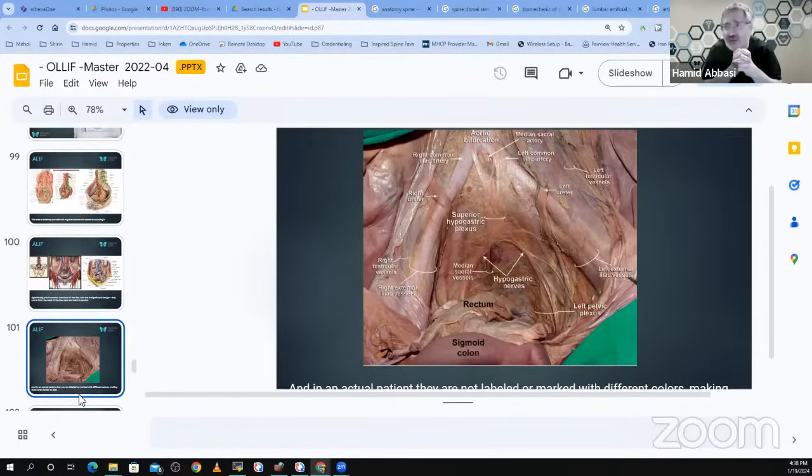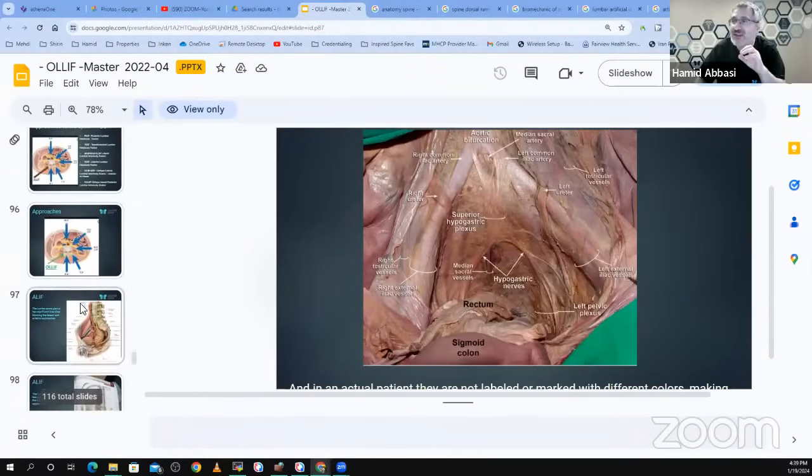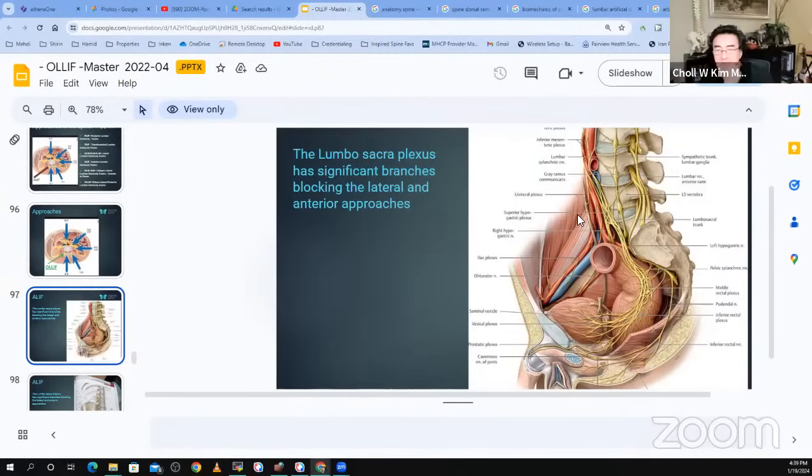You have to identify all those vital structures. You have to preserve them. What if I told you in this town, once a year, somebody dies of that surgery from the front, at least, that we injure certain structures that are very vital. And you have to do all of that before you get where you need to be, which is the disc itself from the front, before you can put that artificial disc in. So just getting there is a big deal.